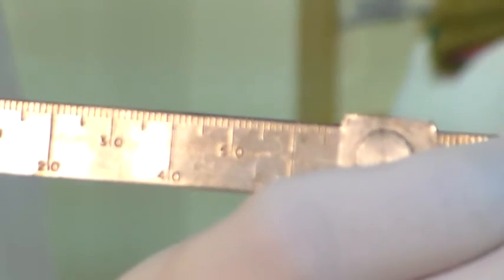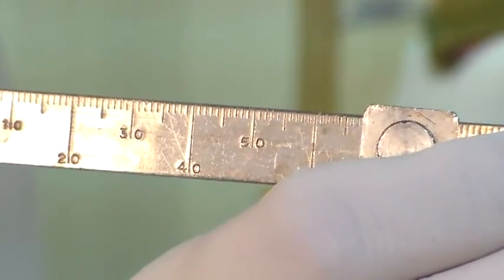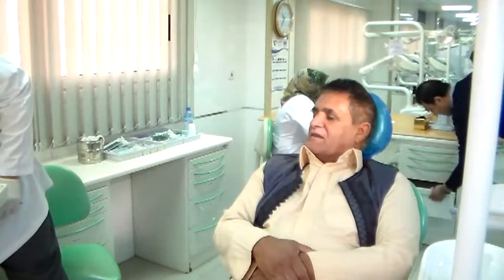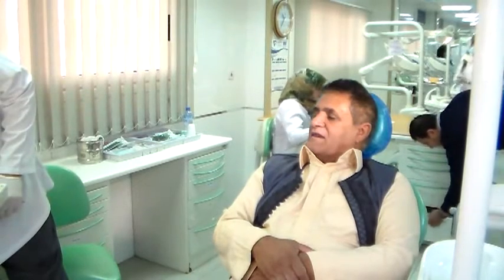So this time the reading is close to 68. It's okay. So I have 4 readings now, and the readings go 67, 67, 68, and 69. So I'm going to stick with 68 as my vertical dimension at rest, because that seems to be the average. That means with a gap of 4, I'm going to have a vertical dimension of occlusion of 64.